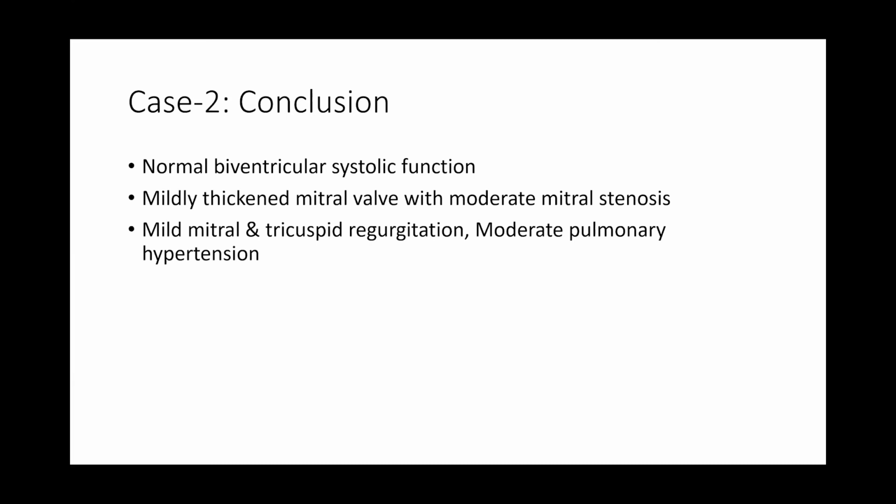So Vishal, in this context, how much would be the contribution of the COPD to account for the pulmonary hypertension? 100%, definitely a contribution from that. That's the second reason that you cannot blame the mitral stenosis for all the pulmonary hypertension. Again, you need to compare with the previous echoes for that.